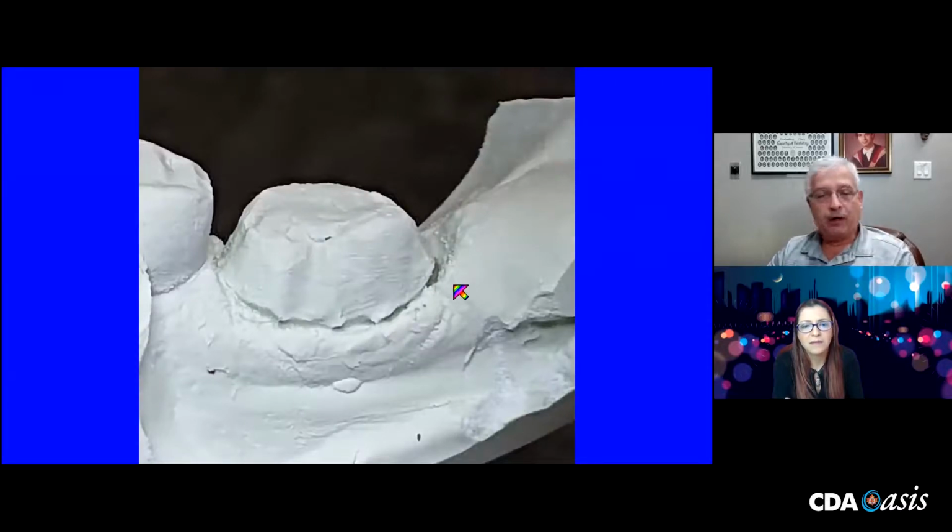So we can all have a bad day, and this is my impression. I took this of somebody, and this crown was cemented in a week or so ago. And took the impression, I thought it was okay, sent it off to the lab. The lab and I have an arrangement. They have to supply me with the perfect fitting crown, but I have to supply them with the best impression I can, or we call each other.